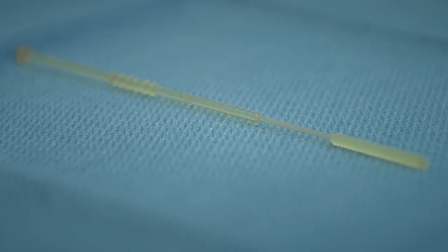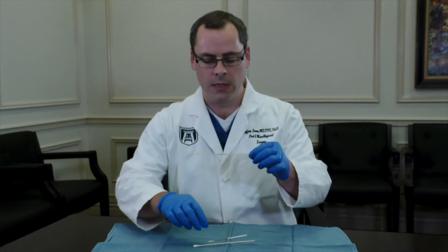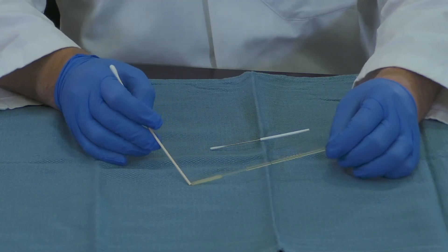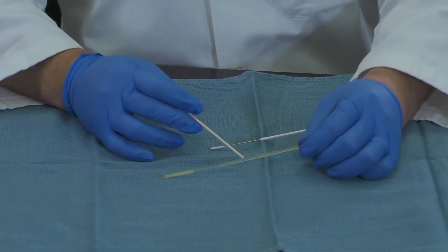We've been able to develop a 3D printed version of a nasopharyngeal swab. This printed version has an increased surface area to collect specimen at the nasopharynx. It has your standard breakpoint for all standard swabs to be placed into your transport vial.